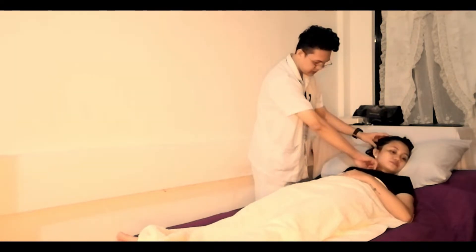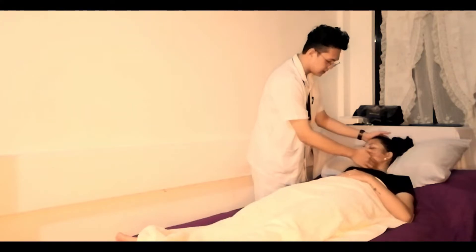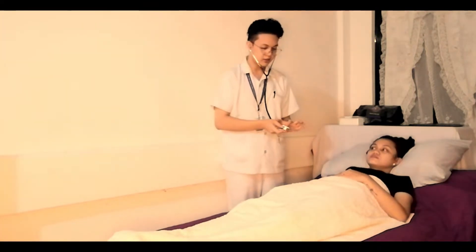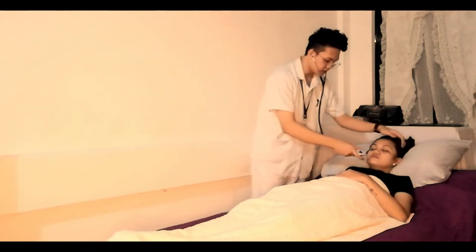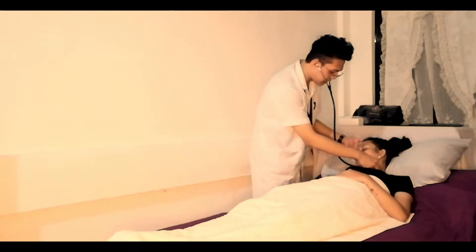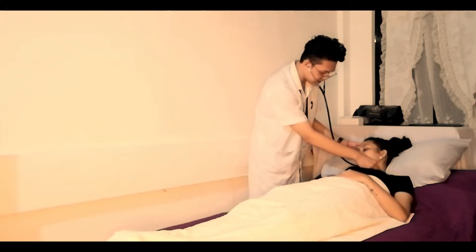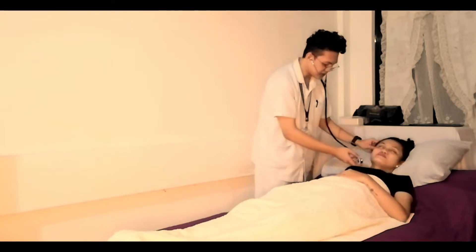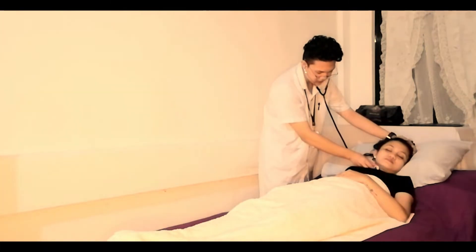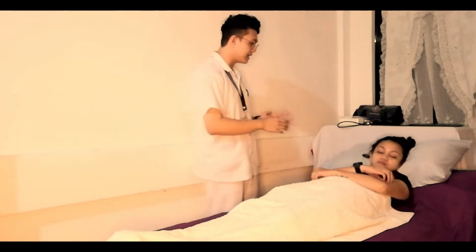I'll be taking the digits of your hand towards the left and palpating your carotid artery. I'll also be auscultating your carotid artery using the bell of my stethoscope to hear low-pitched sounds. Can you tilt your head to listen? Can you inhale and exhale, then hold your breath for a while? Now inhale. On the other side — inhale, exhale, and hold. You can relax now. I haven't found any carotid bruit bilaterally on your carotid arteries.